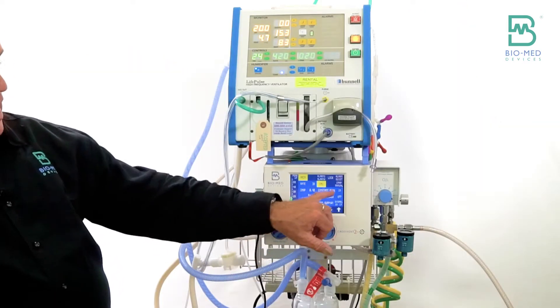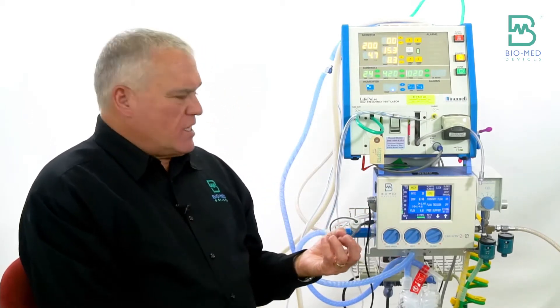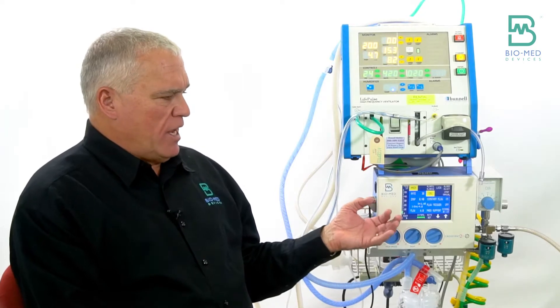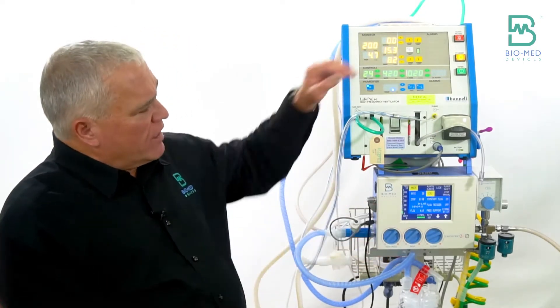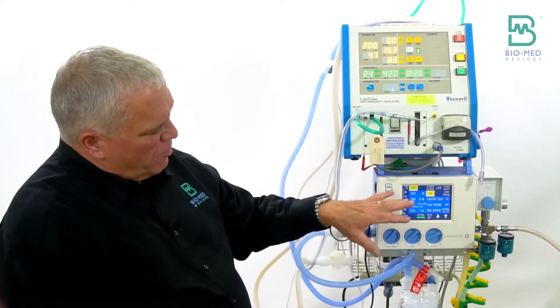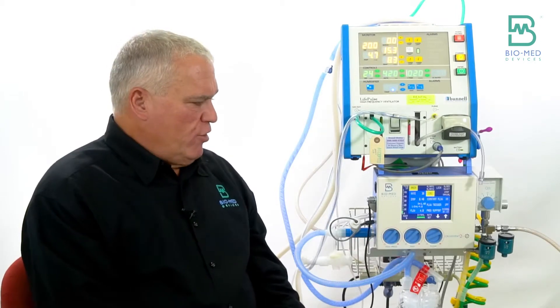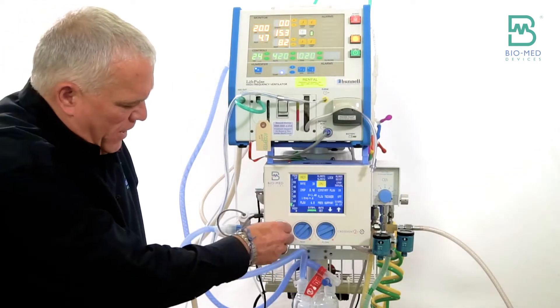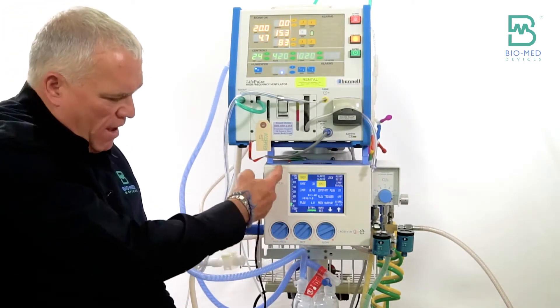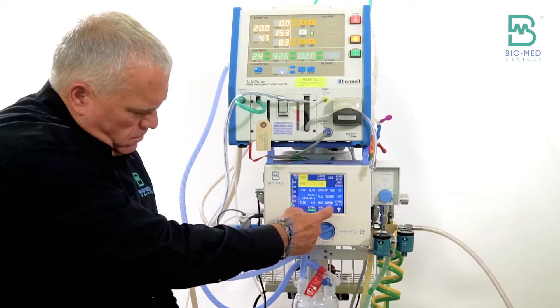You're going to use it in constant flow mode. Normally with ventilation we use it with flow trigger, so we'll have constant flow on. I'm going to show you how to set it up with a rate first — I've got my rate dialed to 30. Typically you might do a rate of two to five when you're on the jet, but since we set the PIP by looking at the peak pressure and adjusting the knob, I'll dial my rate to 30 so I can see it cycle several times and get it adjusted.